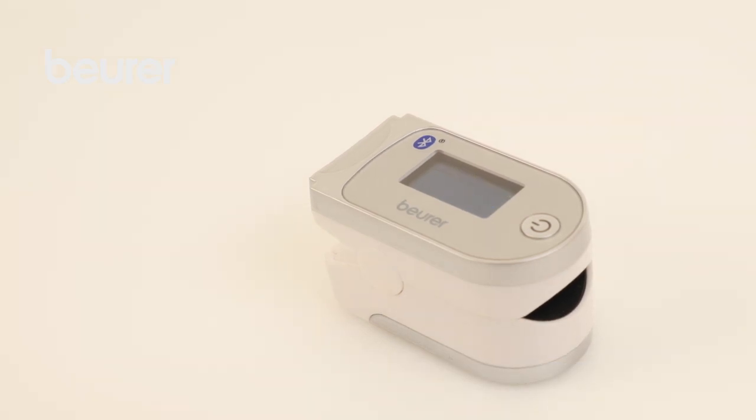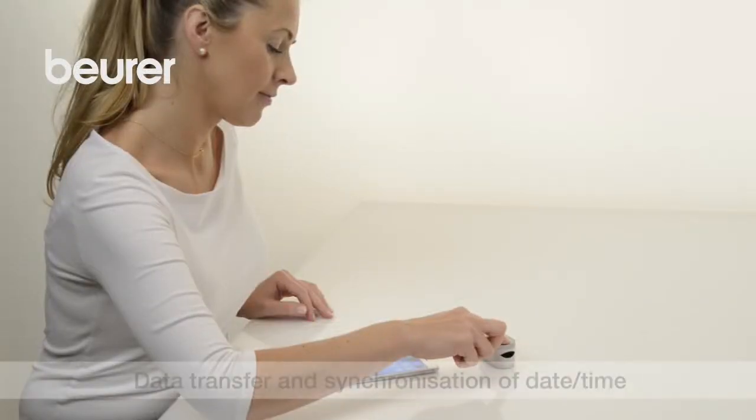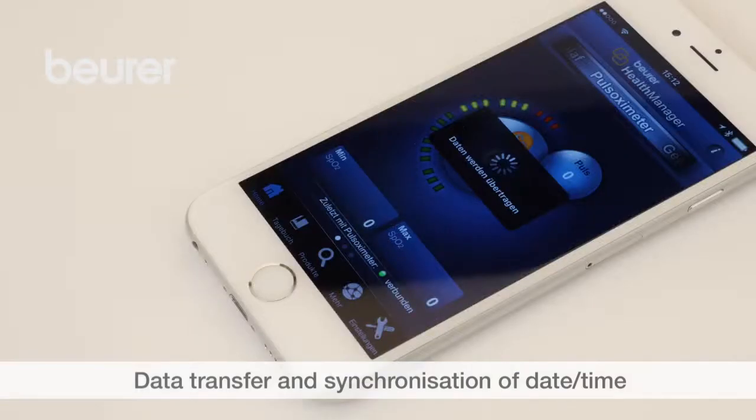If the PO60 is switched off, you can press and hold the function button to transfer the data to the app.